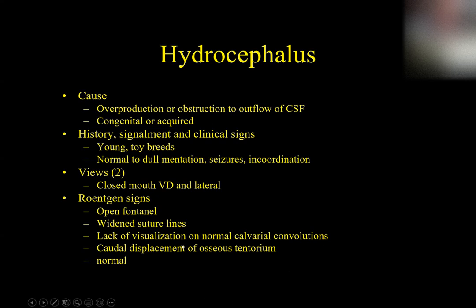So what are Röntgen signs? Well, this is a tribute to Wilhelm Röntgen. So whenever we talk about Röntgen signs, and I'm sure Dr. Warner talked about this with you, we talk about what do we see on x-rays that would suggest a certain disease condition, in this case, hydrocephalus.